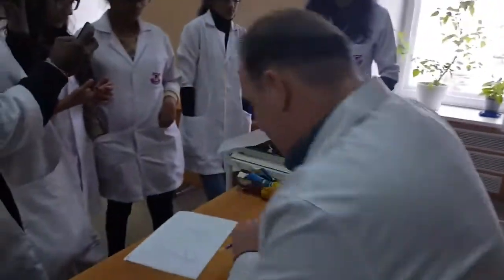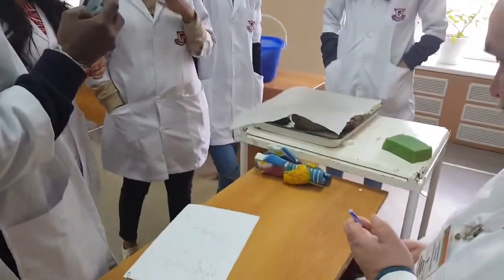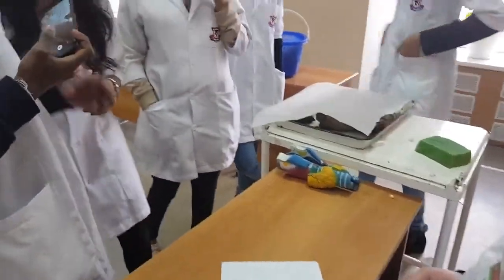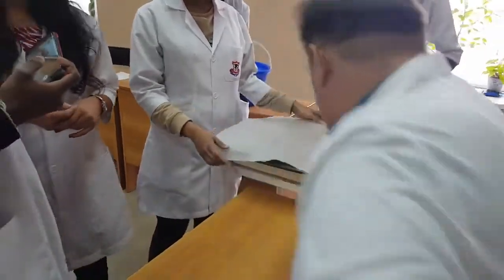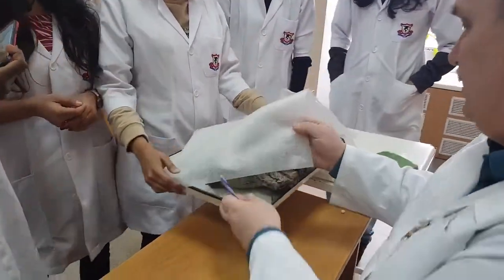Come here. And where is forceps? Just a minute, I want to do this.